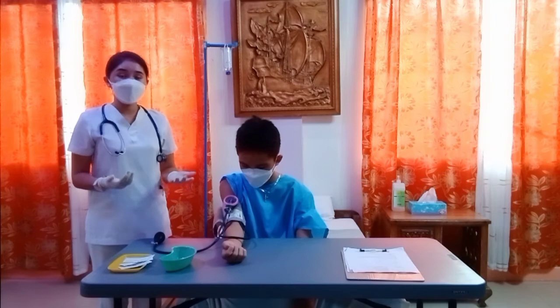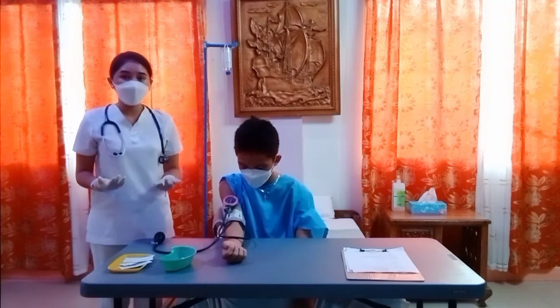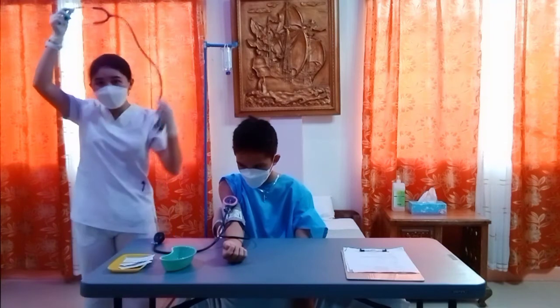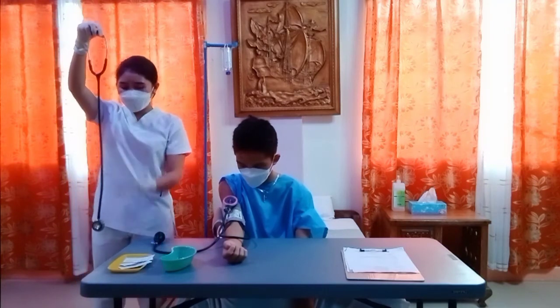This is done to ensure that the cuff is placed in the proper placement and it gives an estimate of the systolic blood pressure. Next is to clean the earpiece of the stethoscope and ensure that the diaphragm hangs freely.